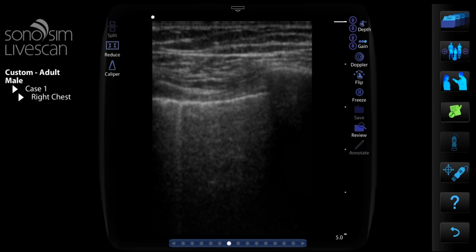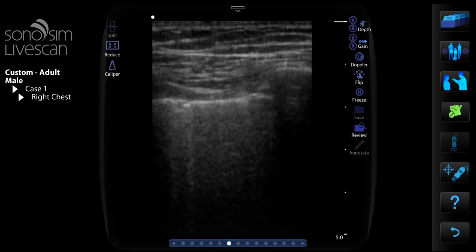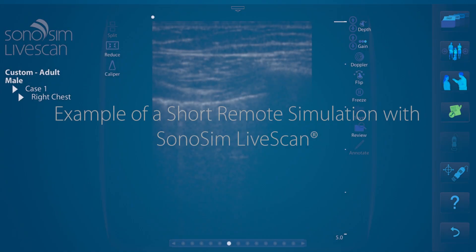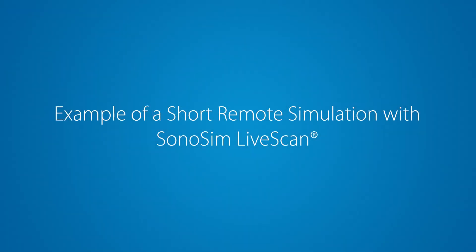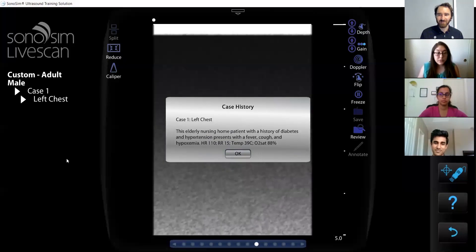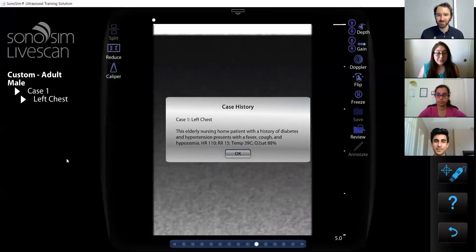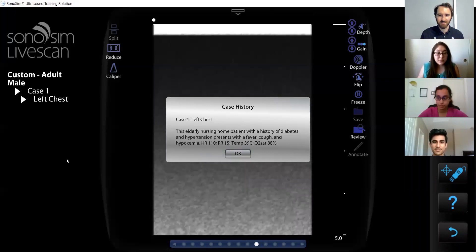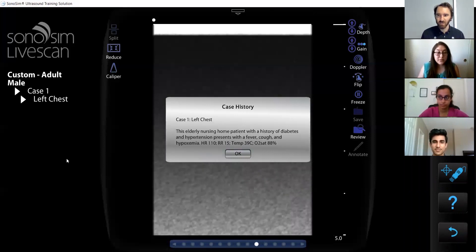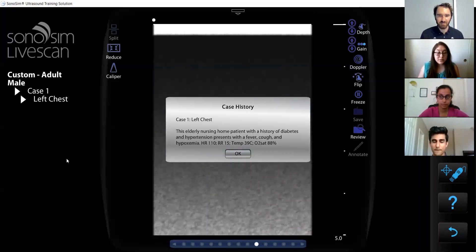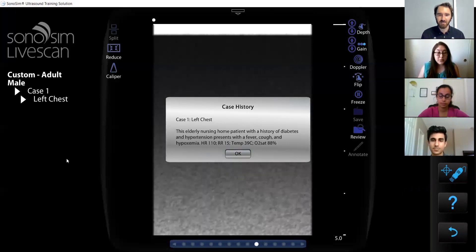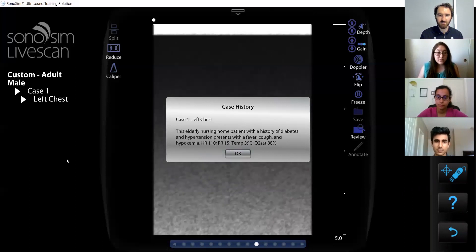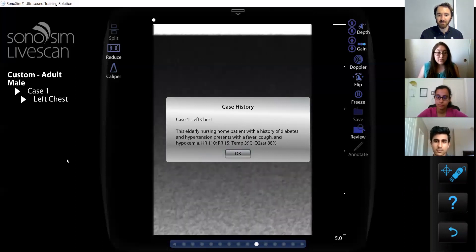When your case is ready, start up any video conferencing software and you are ready to start your remote simulation. Hello everyone, it's good to see you. Glad that we're able to join each other remotely here for this remote simulation using SonaSim LiveScan. I have a COVID-19 rule-out patient for you all today. You can see the history right there — this is an elderly nursing home patient with a history of diabetes, hypertension, presenting with fever, cough, and hypoxemia.